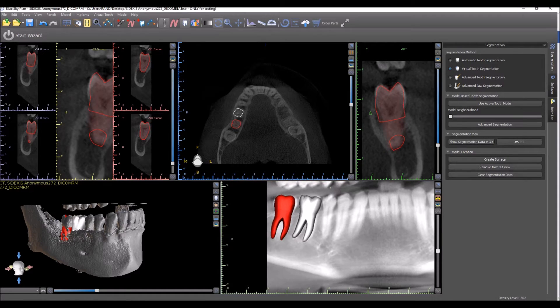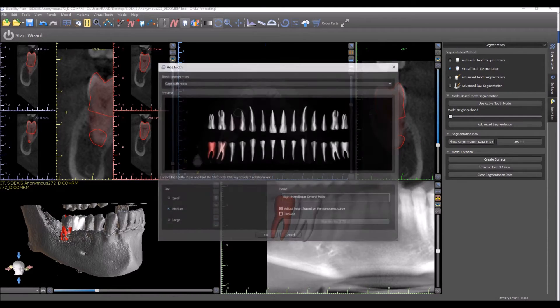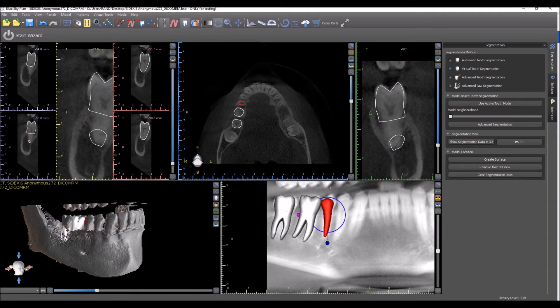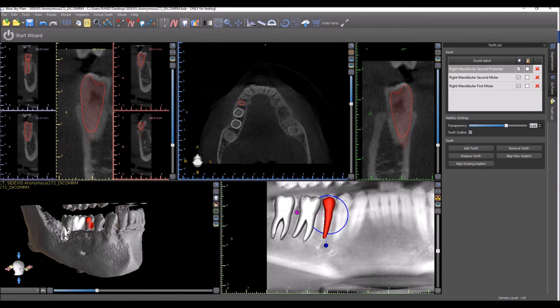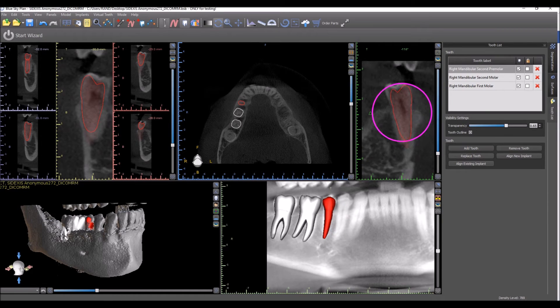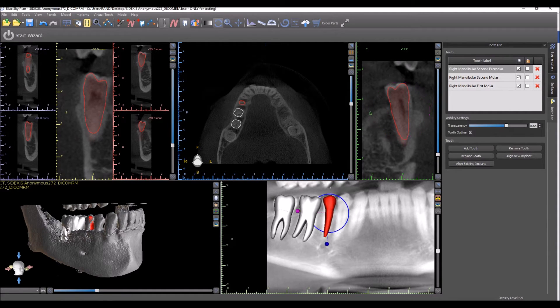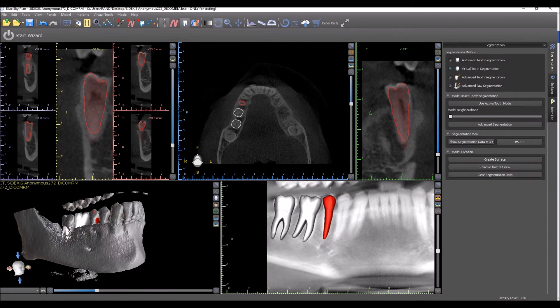On screen we have two virtual teeth placed. We'll place a third one just for demonstration purposes. Here we're placing the teeth with roots, and we could select small, medium, or large. We could select the tooth that we want to place, and if we hold down the Shift key, we can multi-select and drop in several teeth at a time. Right now we're dropping in a single tooth, placing it and changing the angle. To double-click on it, it becomes active and shows up in all the different views. The top-right tangential view is a very good way of placing the virtual tooth, rotating 360 degrees around it to make sure it's properly placed. We can change the size of the tooth by grabbing the nodes to change the length or the width, and of course to grab and drag or to rotate.